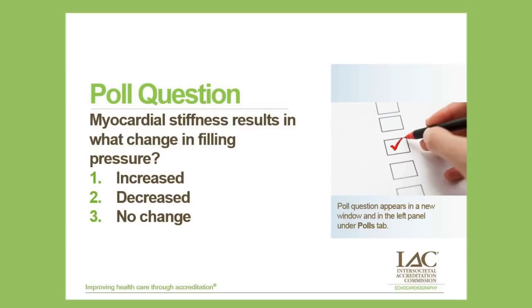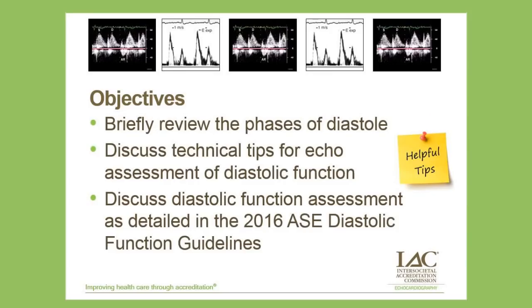So the results are in, Mary, and 73% of the audience say increased, 24% said decreased, and 2% said no change. Okay, so that's where we're starting. Let's move on. So what I want to do during this webinar is to just very briefly review the phases of diastole.